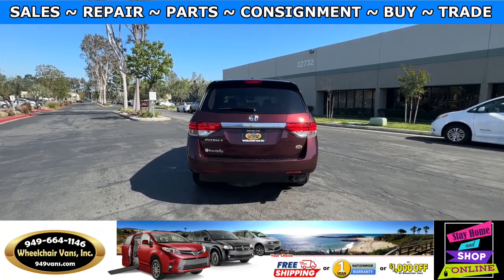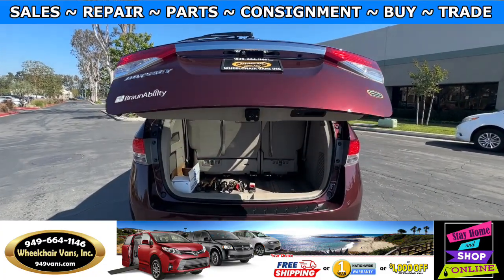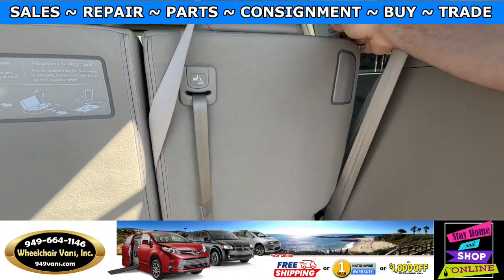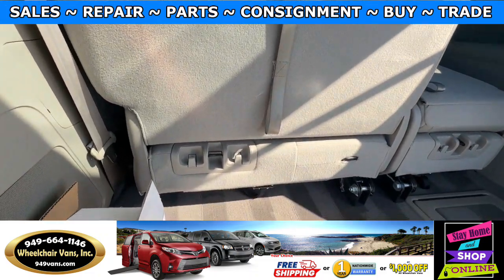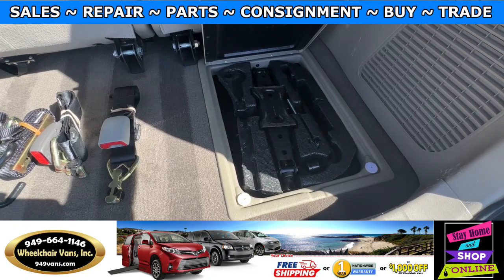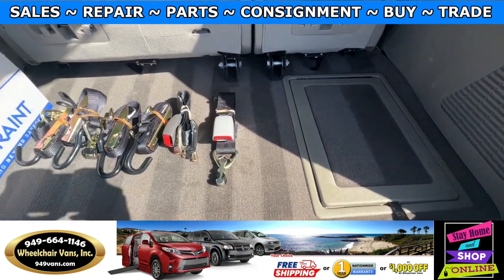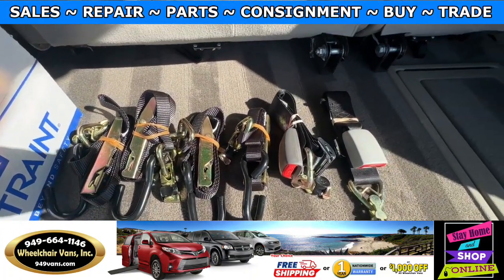Let's go ahead and check out the rear hatch. This is going to have the automatic lift gate and a backup camera. Over here you will have seats that fold straight down. In this compartment you will have the tools for the spare tire. The spare tire will be located underneath the vehicle. We also provide everyone with a set of manual straps.